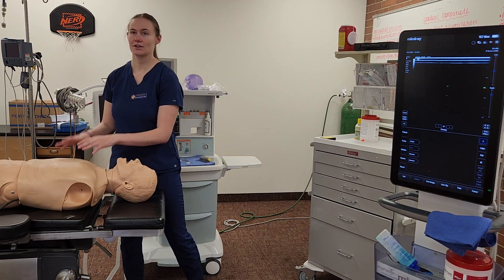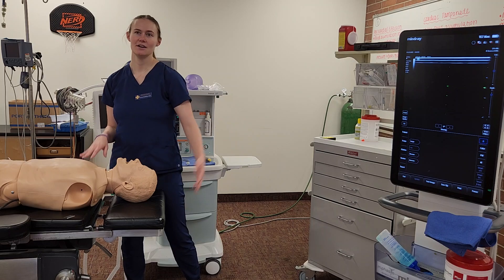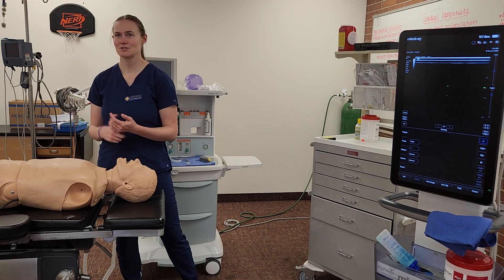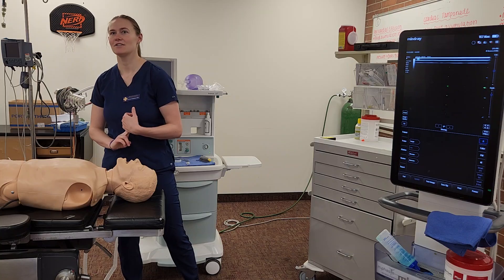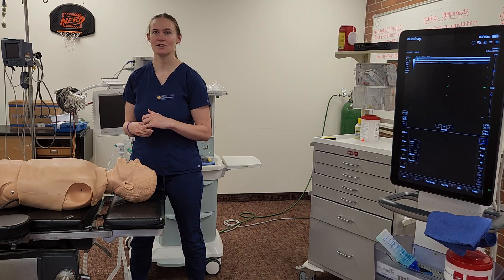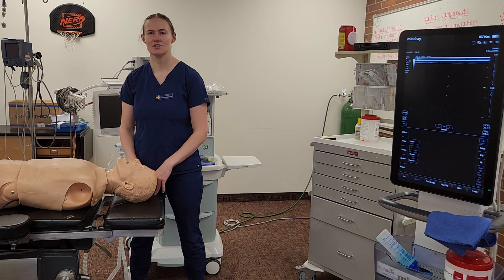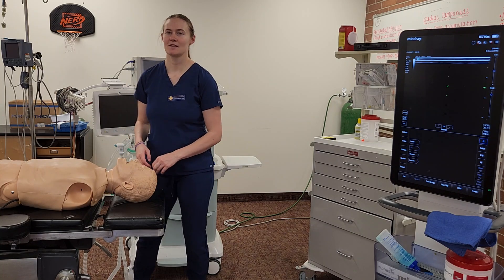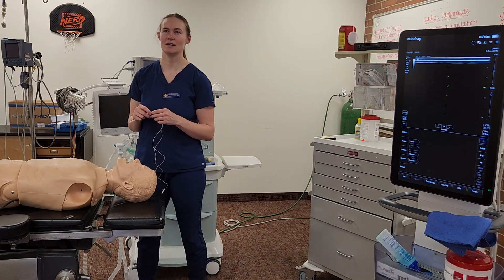Now I need to gather my axillary block supplies because I'm doing a block with this case also. I'll have my ultrasound machine, a sterile sleeve, some gel, nerve block tray, 30 mls of bupivacaine 0.5%, a 5-centimeter 22-gauge B-Bevel Stimuplex needle, peripheral nerve simulator, an open injection pressure monitoring system, stopcock, normal saline for hydrodissection, ChloraPrep, and my sterile gloves. Then I'll set up my nerve simulator and sedation meds.